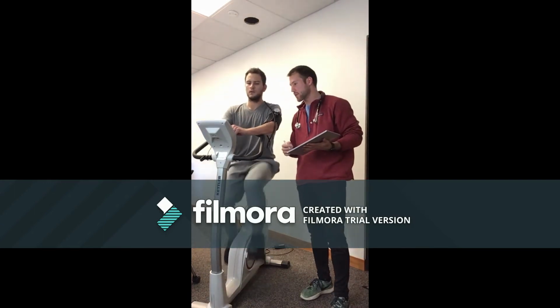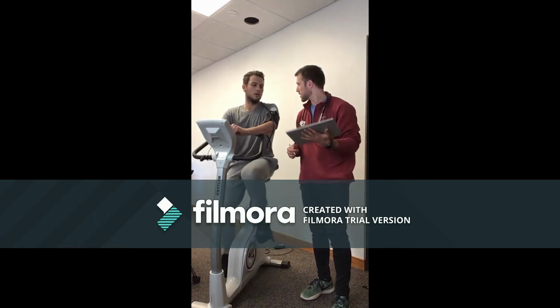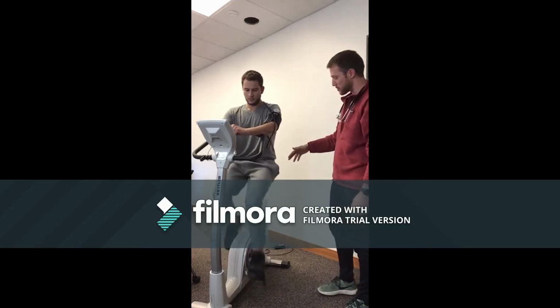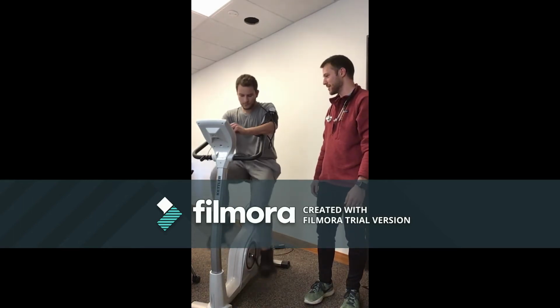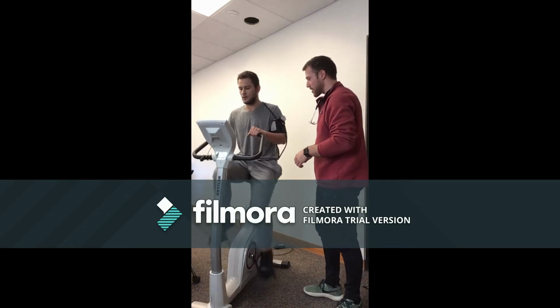Hopefully, with our next minute here, we're going to see that that's going to be roughly the same for those, and that we'll reach that steady state. Okay. So you're looking good. I forgot to mention before, but as I talked to you about, we set that seat height to be at the height of your greater trochanter to make sure it was going to be the appropriate length for you as well. So we're actually already now at that 6th minute. Let's take your vital signs once again.